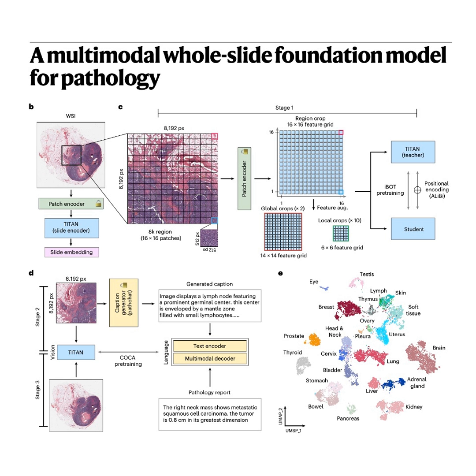Then, once Titan masters those fine-grained visual concepts in stage 2, it moves to stage 3, global alignment. And this is where the real reports come in. This is where it aligns the entire WSI with those 182,000 actual clinical pathology reports. This is the pivot point. It is where the model connects local microscopic observations with global diagnostic terms and clinical reasoning. It learns to speak the language of the hospital. That is a true three-stage master plan. First, general vision encoding. Second, fine-grained language learning with AI-generated descriptions. Third, high-level clinical reasoning with actual doctor reports. It ensures the model is both microscopically precise and clinically accurate.